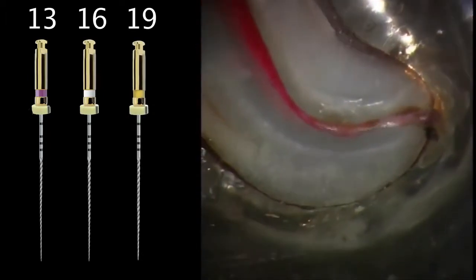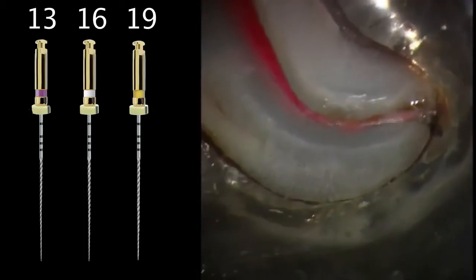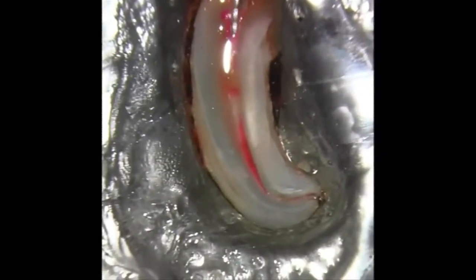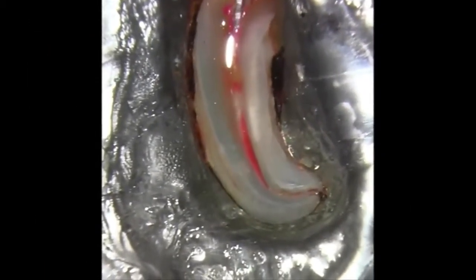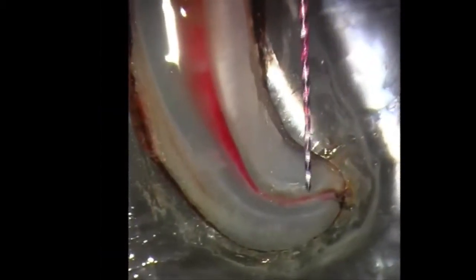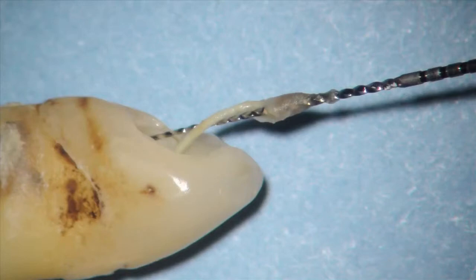These path files are used at 300 RPMs and enable the clinician to prepare the pathway in a canal without deviating into the canal wall. An added advantage is its ability to grab the pulp tissue that, in many cases, results in a complete pulpectomy.